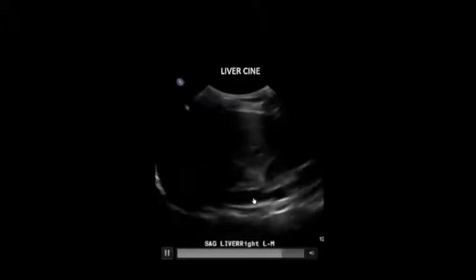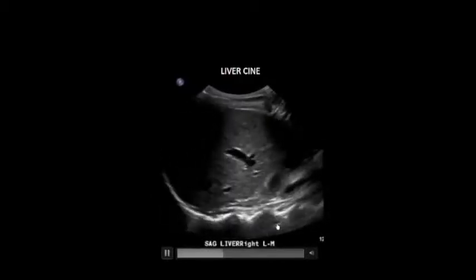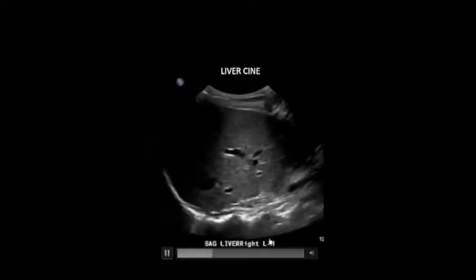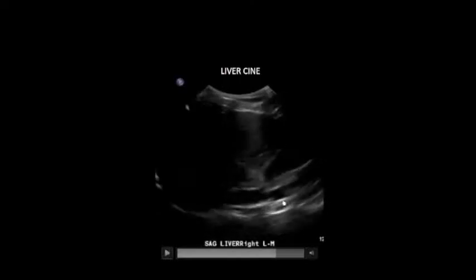Those, to me, are the most fearsome ultrasounds that are done by people in the evening or night who are not experienced. Because if that one thing is down in the neck and the angle is such that you can't see the neck of the gallbladder, that's it. You missed the one stone. So, as I say to my residents, I'd rather see your images that show me this. The patients I worry about the most are the ones that look like a fat gallbladder with no stones, that you missed it. So, beware the one stone in that area.